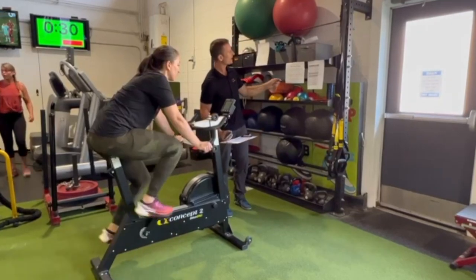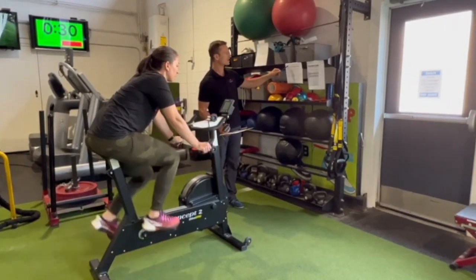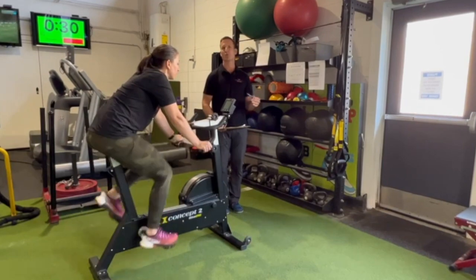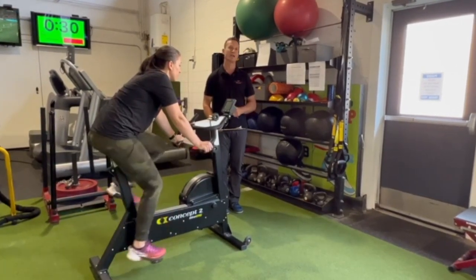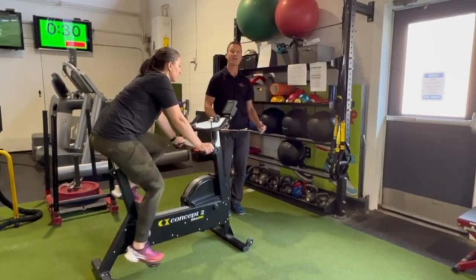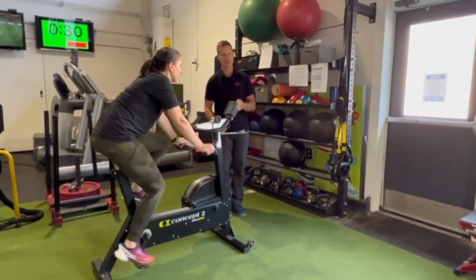So we're using these two scales here. We've got a 10-point Likert scale, 0 to 10, to identify the starting point for whatever the most prevalent post-concussive symptom is for the athlete or patient. So it might be headache, dizziness, nausea, whatever that is before they start, they identify a number. If that spikes by more than 3 at any point during the test, it will be stopped.